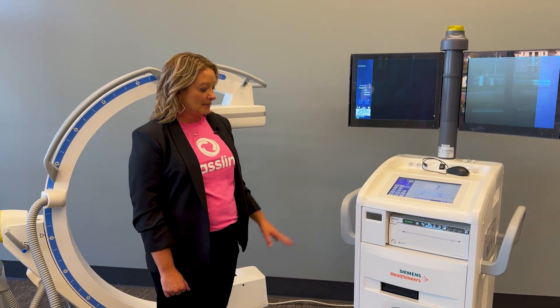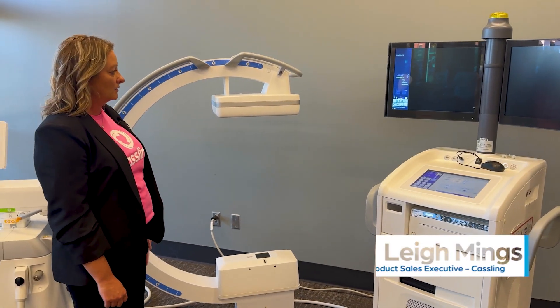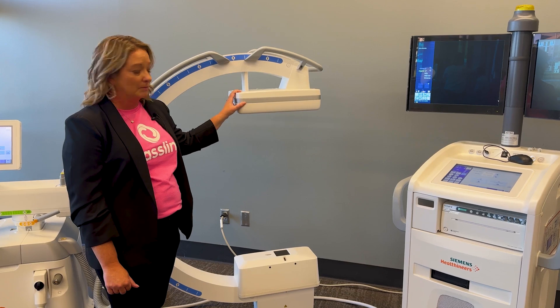I would like to introduce you to the Siemens Seos Flow C-Arm. It is a nice general use C-Arm that you can use from anywhere from pain management procedures to all of general surgery to your neuro spine procedures.